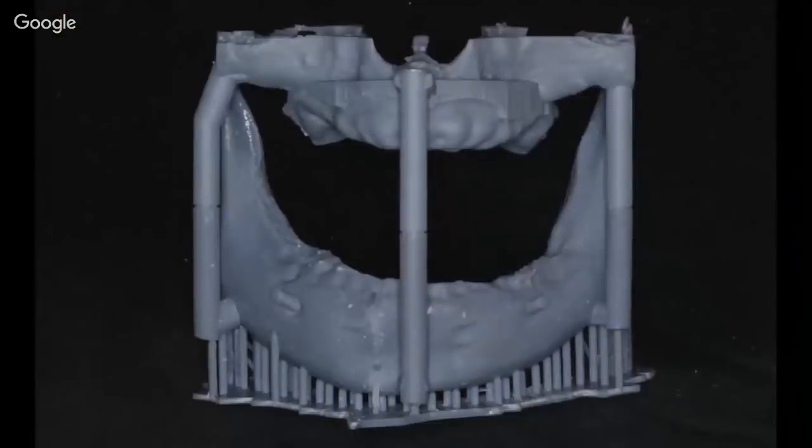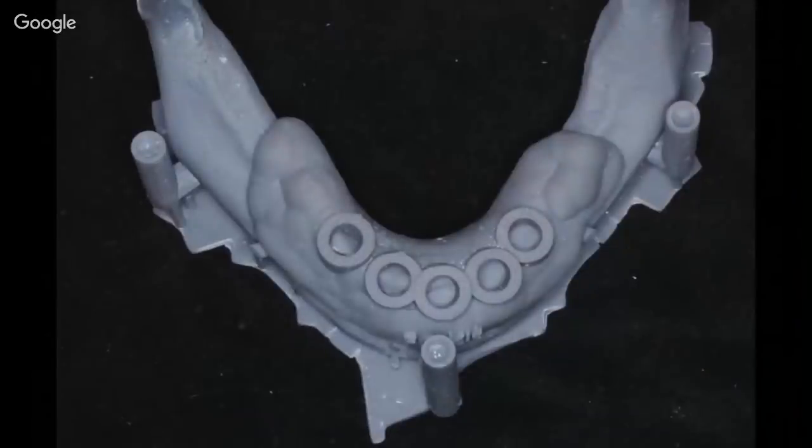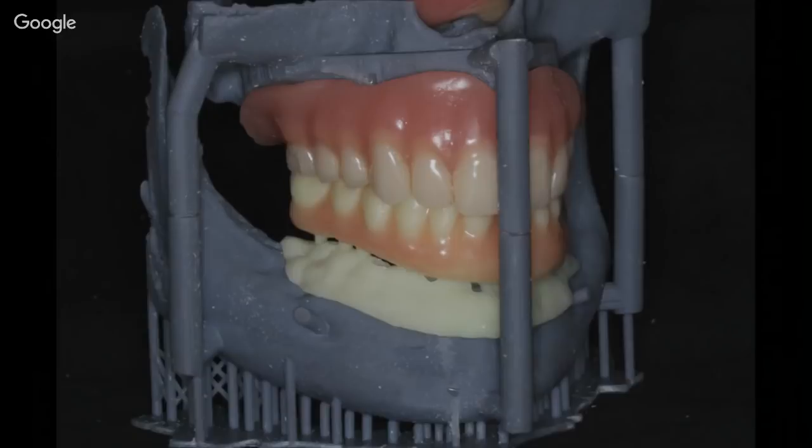Okay, and then just going beyond that, you've got again a bone level surgical guide, and everybody now is going nuts and paying these enormous lab fees to do stuff where there's bone supported guides and then a bone supported temporary restoration so that it drops into place right where it's supposed to be. Well, I got news for you. You can do the exact same thing within Blue Sky Plan. So up here you see a denture that was generated in Blue Sky Plan. On the bottom is a bone tray, and then it's got the digital hybrid, which was designed here, and they're connected together with sacrificial supports. You see these tiny little supports?